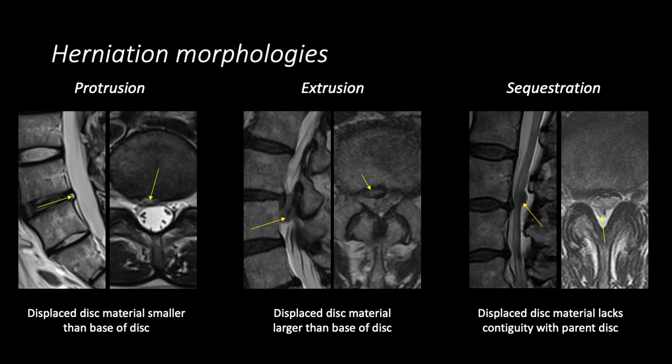Herniations can have different morphologies. A protrusion exists when the herniated disc material is smaller than the base of the disc. An extrusion exists when the displaced or herniated disc material is larger than the base of the disc. You can even have a sequestration where the disc herniation loses contact or contiguity with the parent disc. In this example, we see disc material within the dorsal epidural space on both the sagittal and axial images.